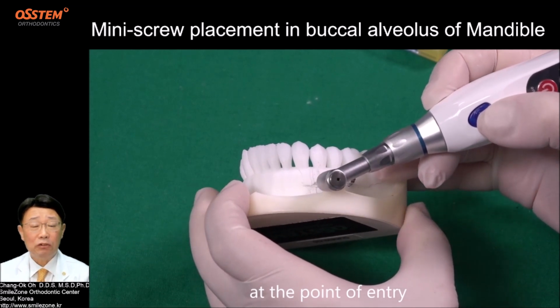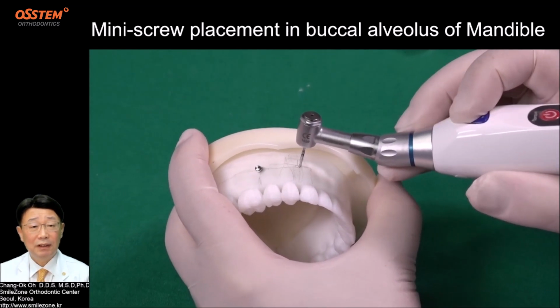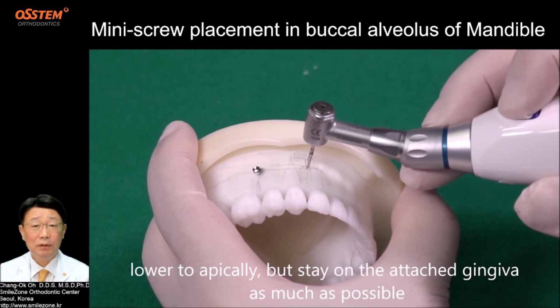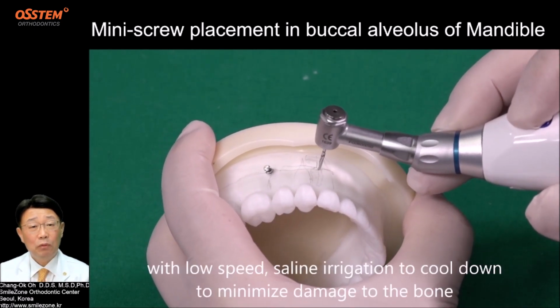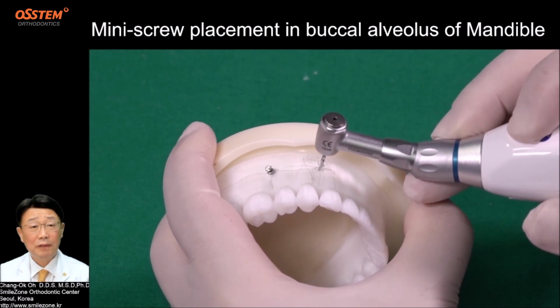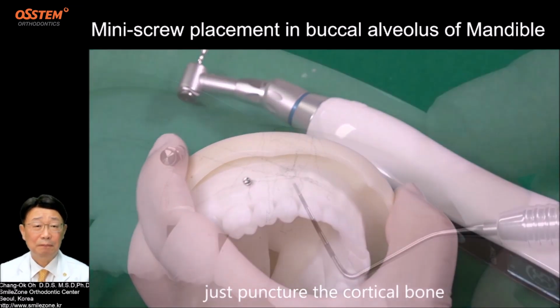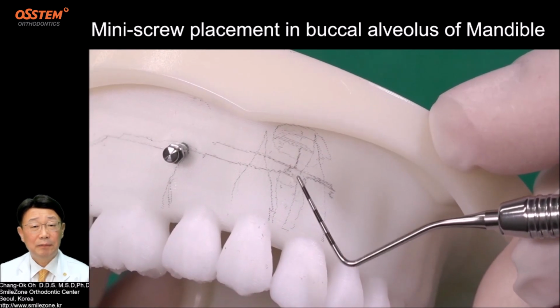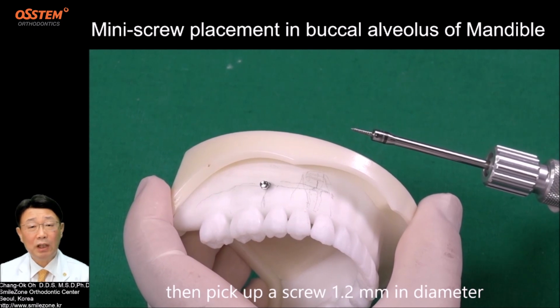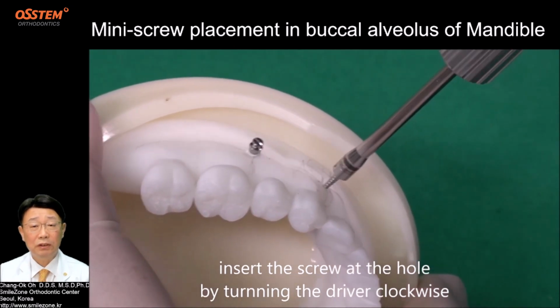Before inserting the screw, drill with a drill 1 millimeter in diameter at the point of entry, at the center between the roots, lower to apically but stay on the attached gingiva as much as possible, with low speed and saline irrigation to cool down and minimize damage to the bone. Just puncture the cortical bone. Then pick up a screw 1.2 millimeter in diameter. Insert the screw at the hole by turning the driver clockwise.